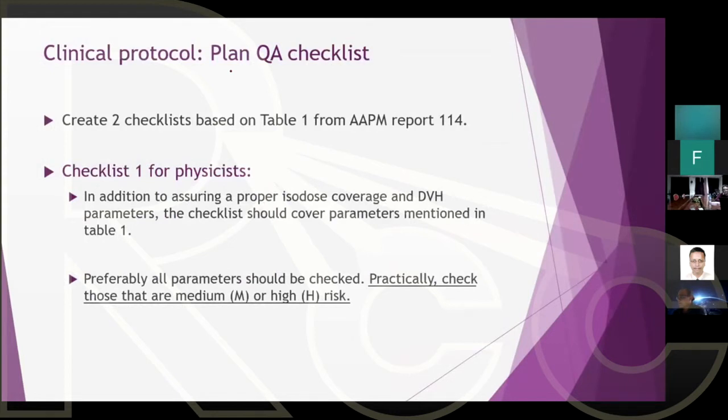Sorry, Dr. Shada. Before we move on, I think this is an important question from Masoud. If there's an error in MU for any reason during treatment, either an increase or decrease in MU, what do you do basically in this situation? Masoud, we're coming to this in the next slides. I'm talking about this today.